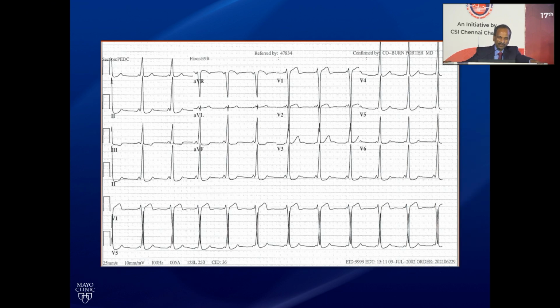If I think back of my career, most common misinterpreted ECG is this one. It happens very commonly all over the world. Somebody will look at this and they will say, this is very tall delta wave, 2-3 AVF, so anterior, maybe septal, this is near the His. You may record little bit His, but this is not a septal pathway. And the reason it is not septal is delta wave is already positive in V1.